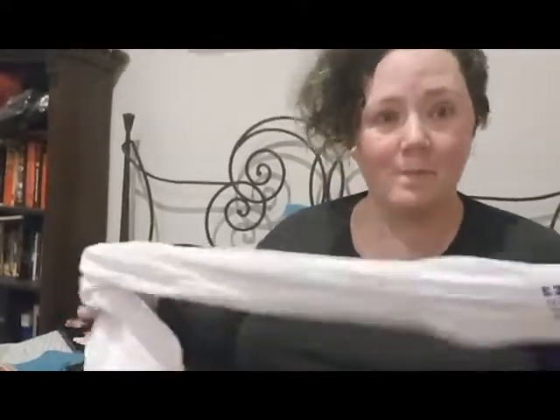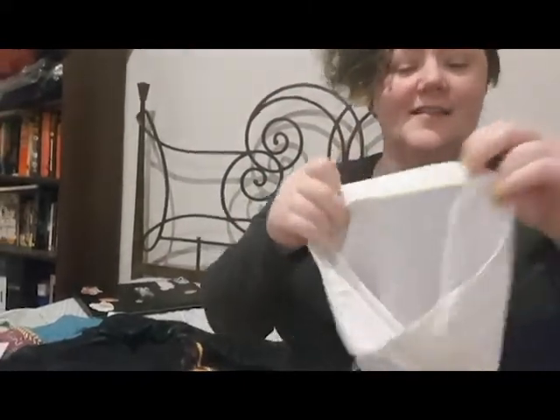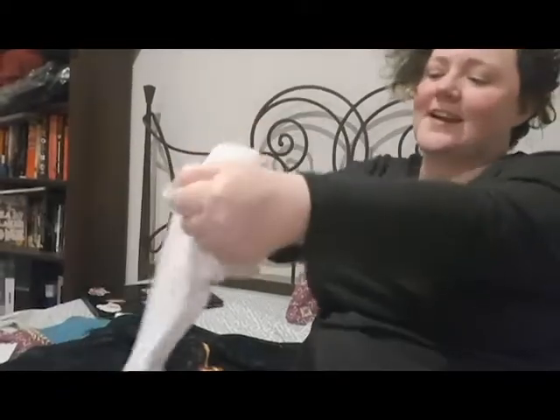Now, let's get to the nitty gritty. First thing that I do, this is what has worked best for me. Make sure that you've got it the right way out. So shiny side for the elastic in, and then I am going to turn it inside out all the way down to near the bottom, and I have it loose.